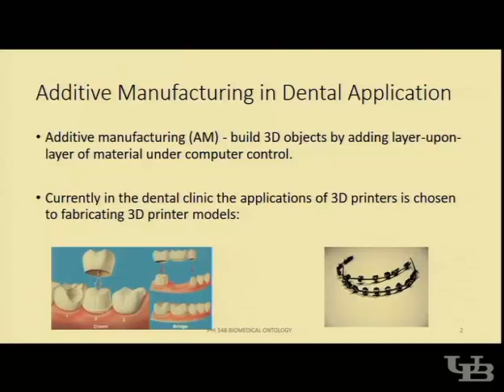The CAD/CAM system has been used in dental applications before, but another process that uses the CAD/CAM system is a subtractive process, such as CNC milling or CNC machining, where it becomes wasteful because they need to have a solid block of material, and they remove the material from there. So it becomes wasteful, and it also lacks complexity, whereas the additive manufacturing process can produce any shape.